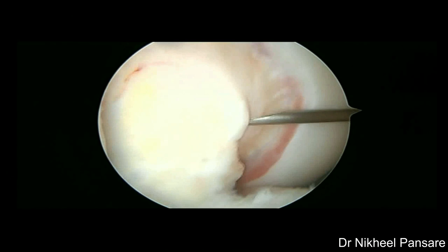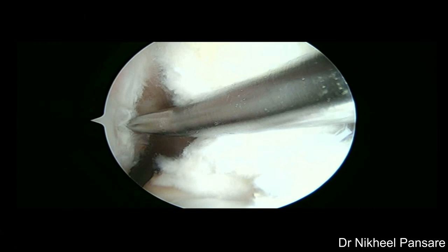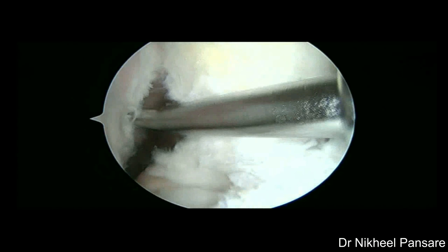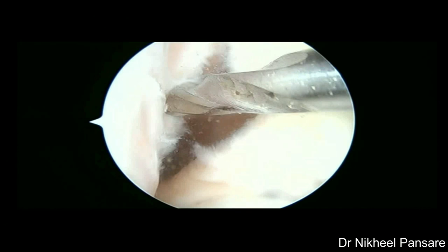We prefer to take an accessory medial portal to prepare the femoral tunnel. Entry is marked over the ACL footprint. The entry should be as low and as posterior as possible with near 90-degree flexion. Always keep in mind the final diameter of the femoral tunnel while marking entry. You can also use an offset guide to mark the entry. Engage the bit pin on the marking, flex the knee completely, and advance the bit pin directing it superiorly and anteriorly.